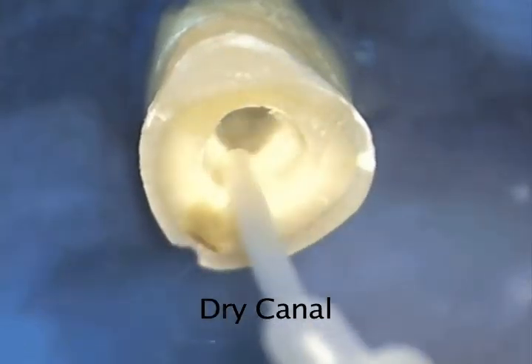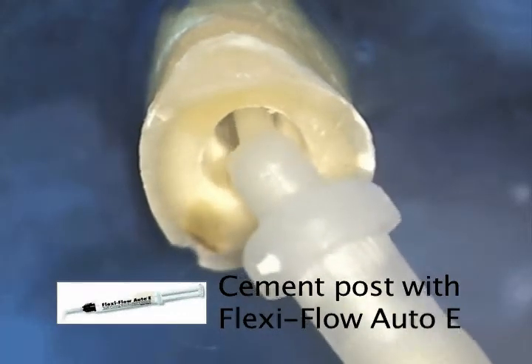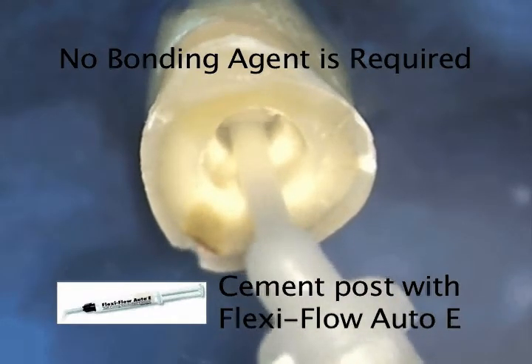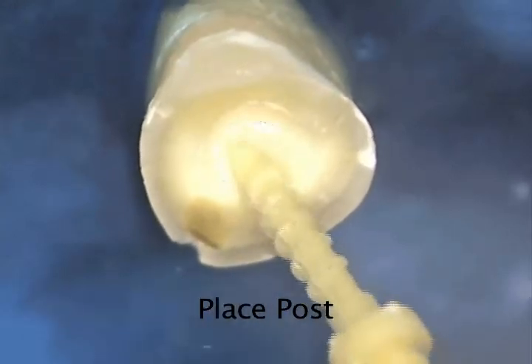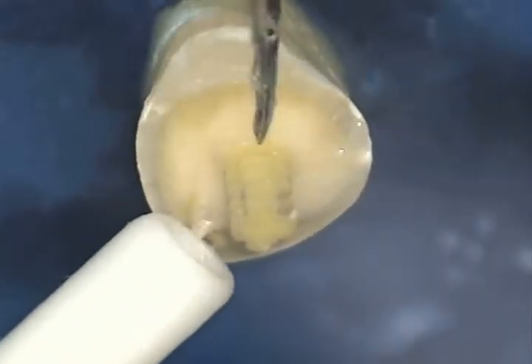We are now ready to cement the post in the root. The canal is dried with air or paper points. We use FlexiFlow Auto-E to cement the post — it is a self-curing reinforced composite cement. We place the micro-tip down the canal and express the cement until the canal and the countersink preparation are filled. The post is then threaded into the canal until the flange is flush with the countersink preparation and comes to a complete stop. Once the post is fully seated, remove the wrench by pulling it straight off. Excess cement can now be removed before the cement sets.